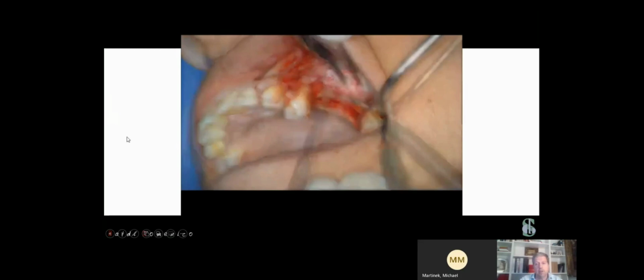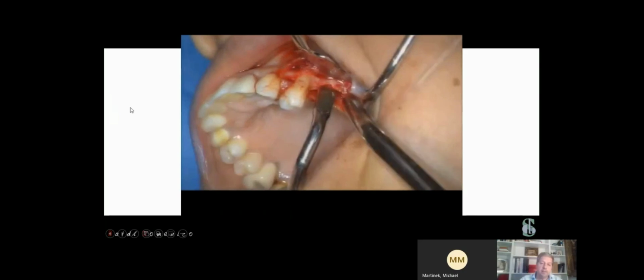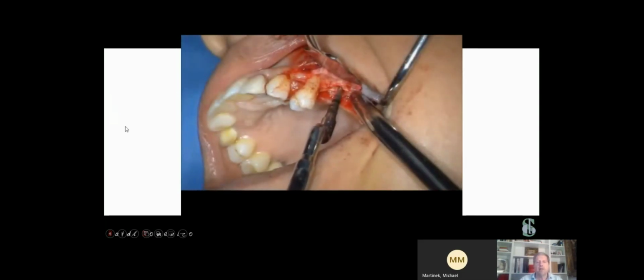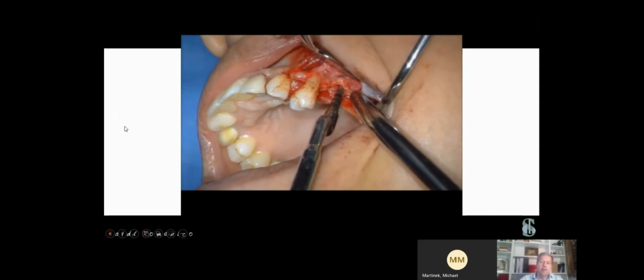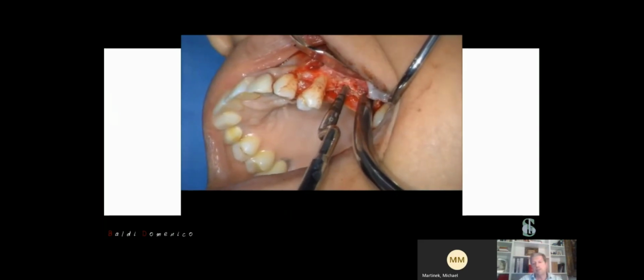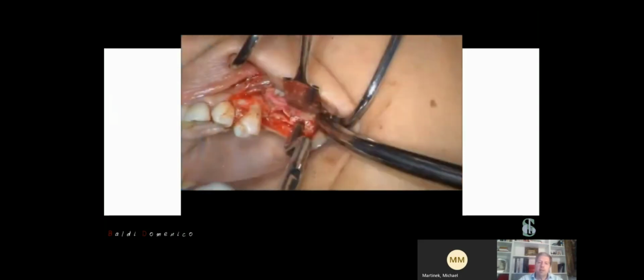Here you can see the video of our surgery. Again, here we decided to create just a little split in the anterior part in order to enlarge our bone. And you can see how it's possible to manage this difficult situation, because we know that a split is not so simple. And here we're using these tips. It's possible to prepare the implant site and at the same time enlarge it. And so we can finish the implant site preparation.